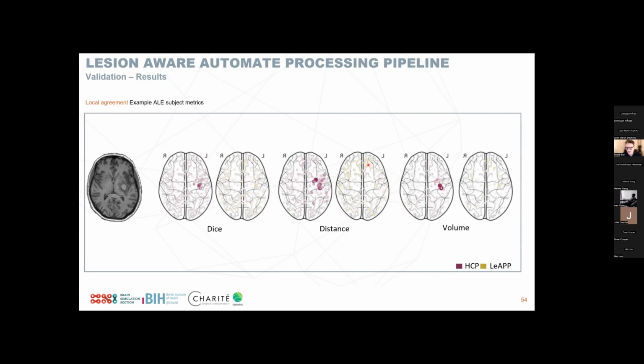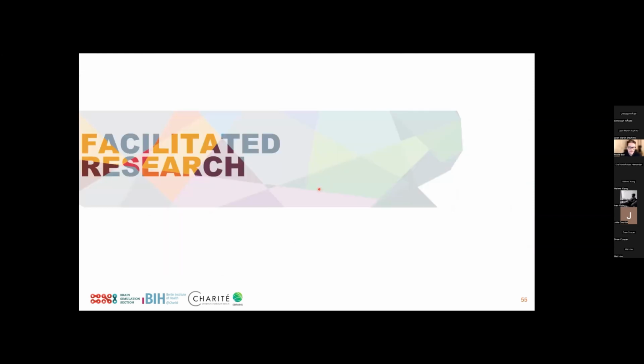We see differences as well in LEAP, and these are some of the limitations that are still present in our mitigation measures, but they are more equally distributed and do not pertain so strongly to the actual impact of the lesion, as we've seen for those HCP processing results where we do not mitigate the actual lesion measures.